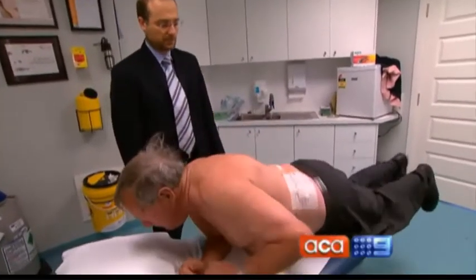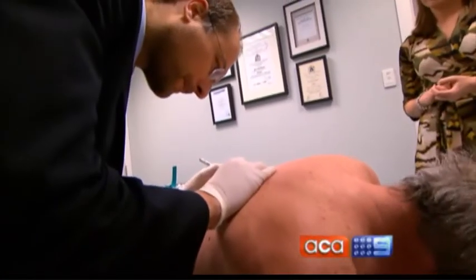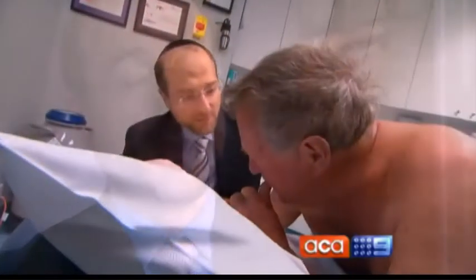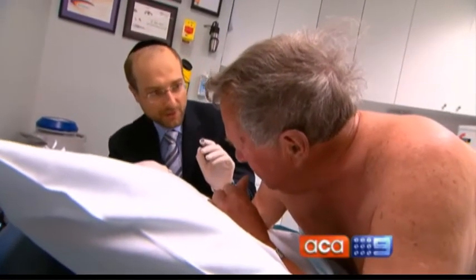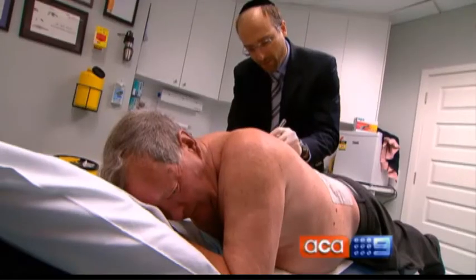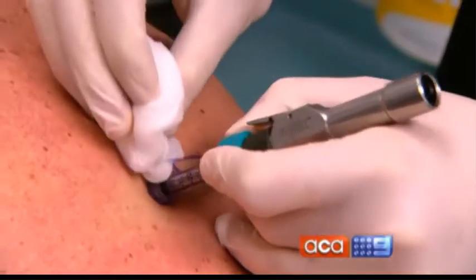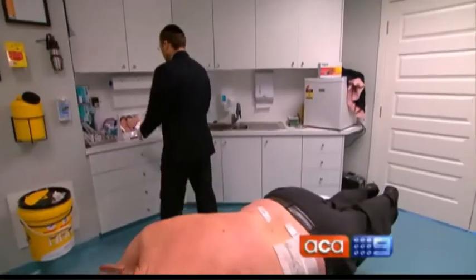Skin cancer physician Dr. Mark Frank is also using it at his Melbourne clinic. Skin cancer particularly occurs in exposed areas such as the face, and they come in here and they're very, very anxious about having needles in their nose or in their lip. Now over here there's no needle on it, okay? So what I'm going to do is I'm just going to push this on your back. Okay, 1, 2, 3. It's used to numb the area around a mole or cancer to be removed relatively painlessly.